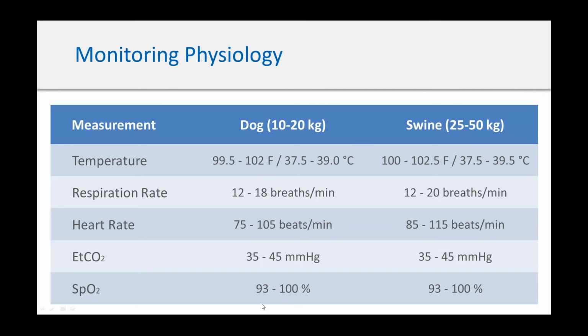We monitor SpO2. Typically, we always ventilate with 100% oxygen, and so this is normally not a problem. Our SpO2s normally are 98, 99, or 100%. We do this more to see if your animals aren't ventilated or intubated correctly, they might be ventilating on one lung, and these numbers would drop, or if there's atelectasis in the lungs, these numbers might drop as well. So we keep it as an overall monitoring of physiologic function. We also monitor ECG in most of the animals just to make sure that there's nothing else interesting going on.